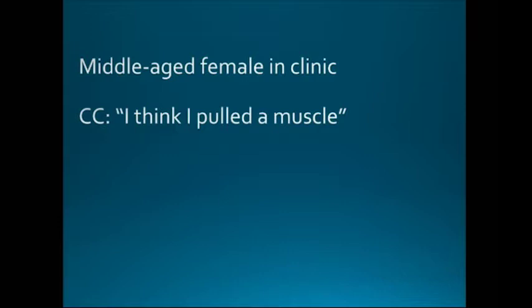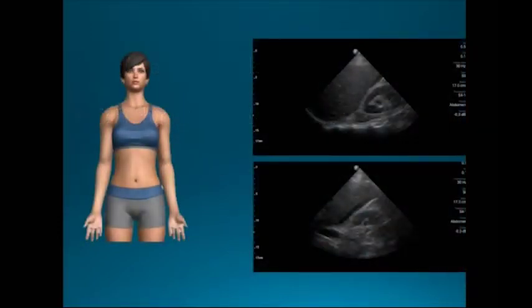And so based on hearing that kind of story, you guys think, she's got a hernia or something, right? She's moving a big old couch. That's what I was thinking. I was thinking hernia. I do an ultrasound physical on my patients whenever I'm not sure, and the chest portion of her ultrasound physical is completely normal. But I get to here, and this is what I see.